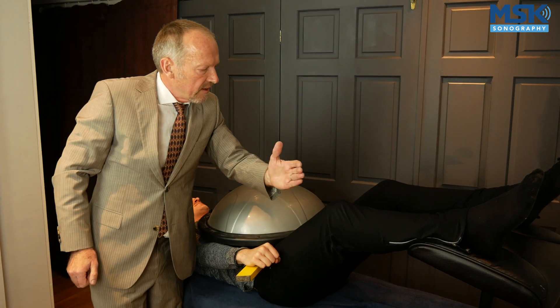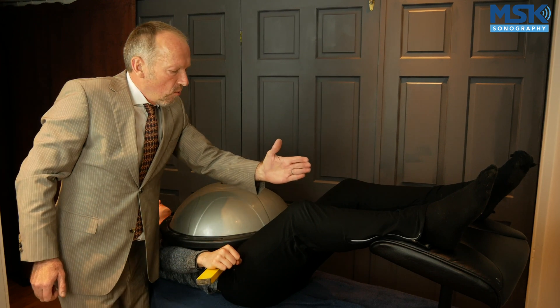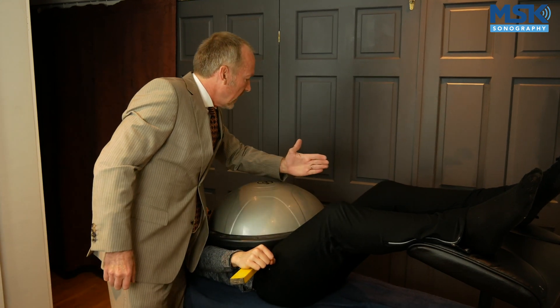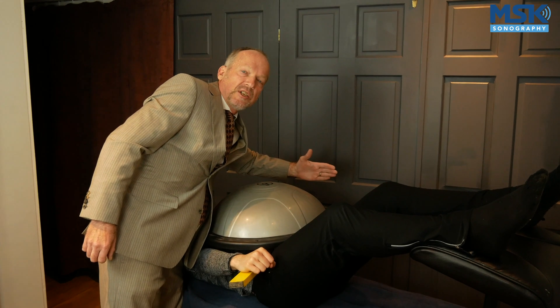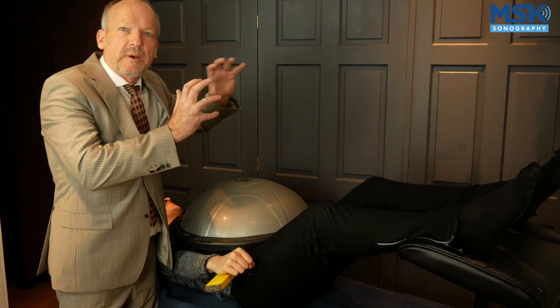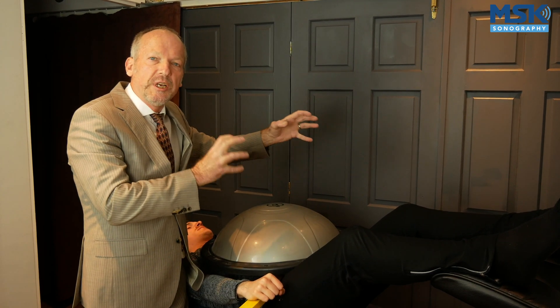As we're scanning through, if we just scan straight through laterally, we're actually in a bit of no man's land because we lose our perspective. What we need to do first is to scan through the metatarsal head, and forget about the structures in the space — find the angle to the adjacent more lateral metatarsal head. It might feel as though you're sliding back 30 to 45 degrees. Once you've found that, you'll see the metatarsal head coming up in the same region on your screen, and that controls your region of interest.